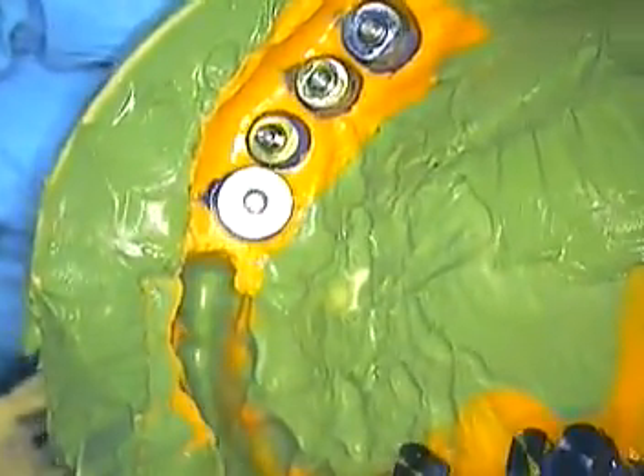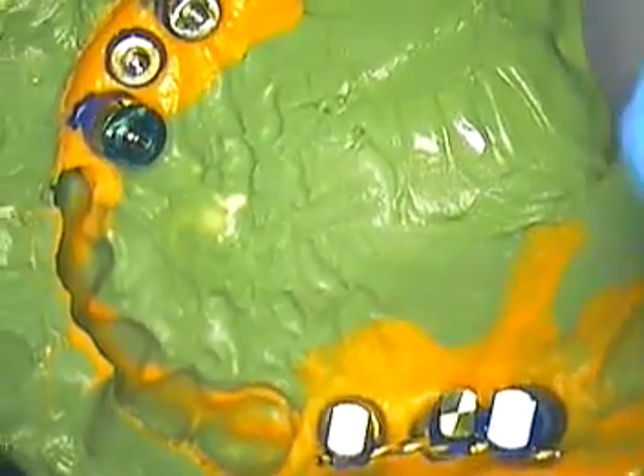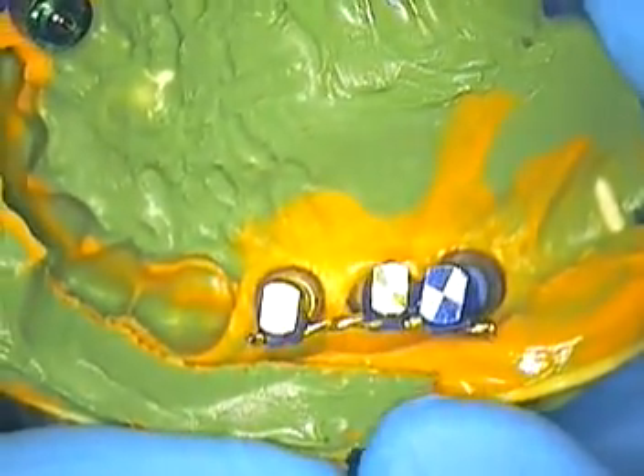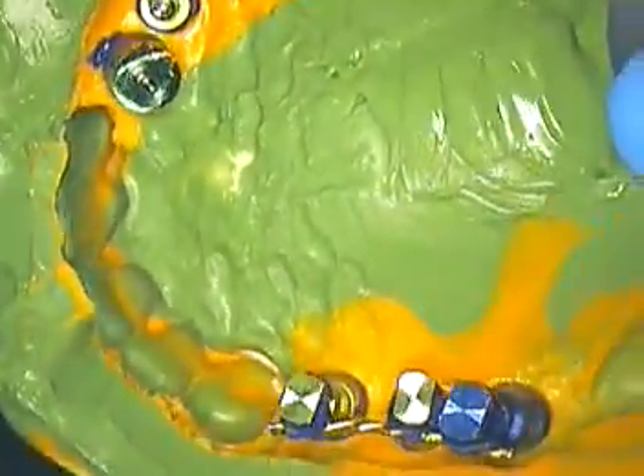This is Dr. Jerry Cuomo. I just thought I would give you a little prelude as to how we make our models. I know I've done this with Ken's case on YouTube, and now we're going to secure the rest of these. I'll do these tonight and have them ready for my lab to go ahead and inject the soft tissue component next, and then do a pour-up.